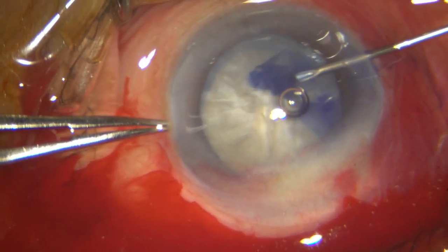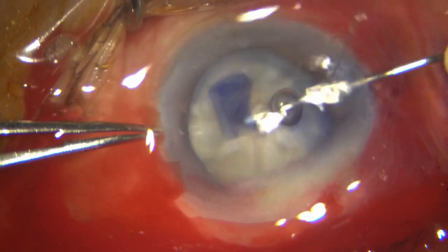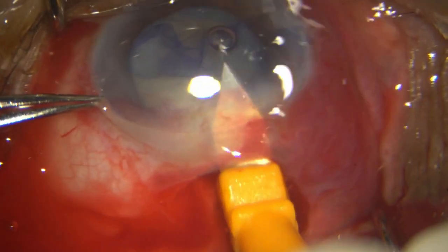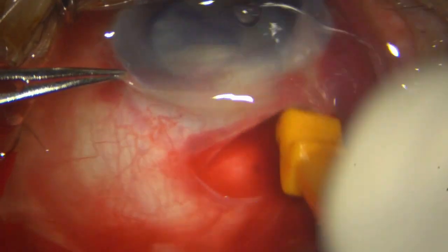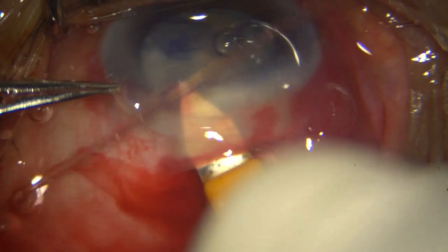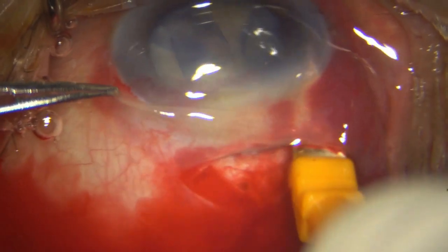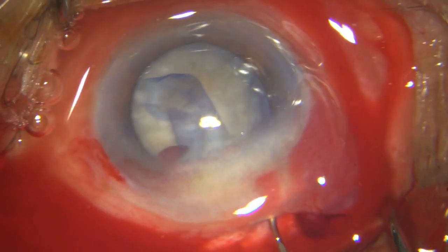So completed the rhexis. And I am now opening up the incision. So far so good, everything has gone on well. But now look what happens now. I have done a good hydrodissection. I think the pole has prolapsed.